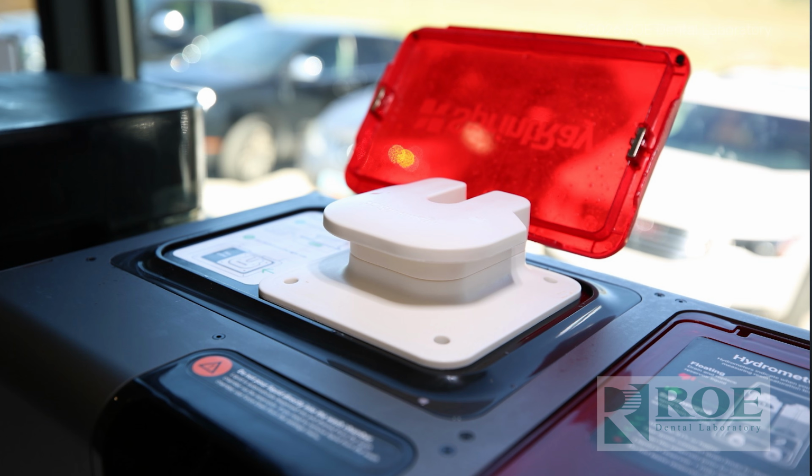And the reason I love denture tooth resin is because I can put it in an automated washer and set it and forget it. If you use resins that are ceramic based or some of the nano hybrid materials, those often need to be hand washed by alcohol because otherwise it will degrade the resin. So those take time. I want less things that my team can screw up or that I can screw up. So that's why I like denture tooth resin.